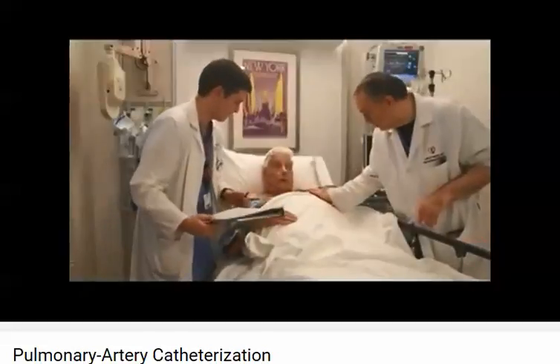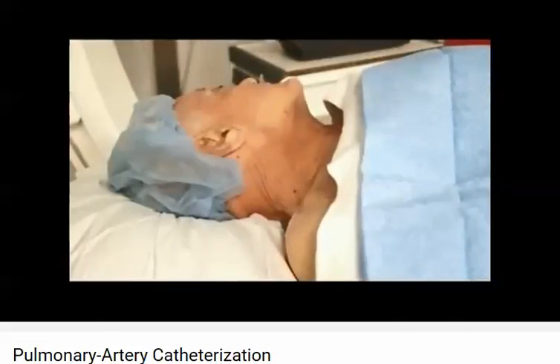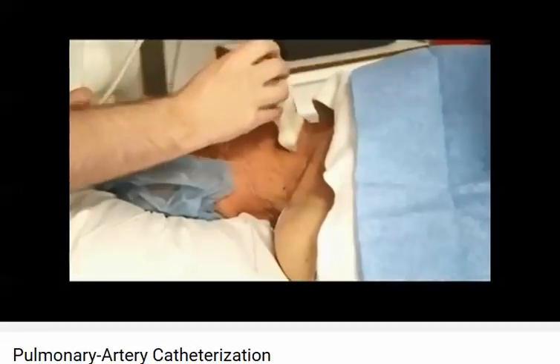After you have obtained informed consent and have reviewed a checklist about the patient and the procedure with the treatment team, place the patient in the supine position. Select a central vein and, if possible, visualize it with ultrasonography to confirm its location and patency.